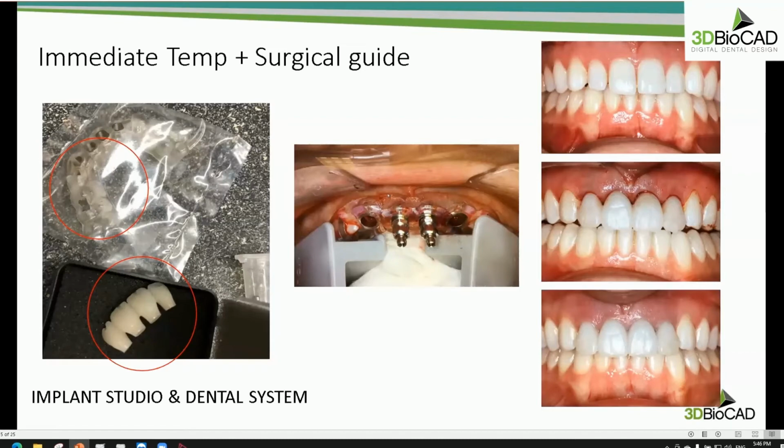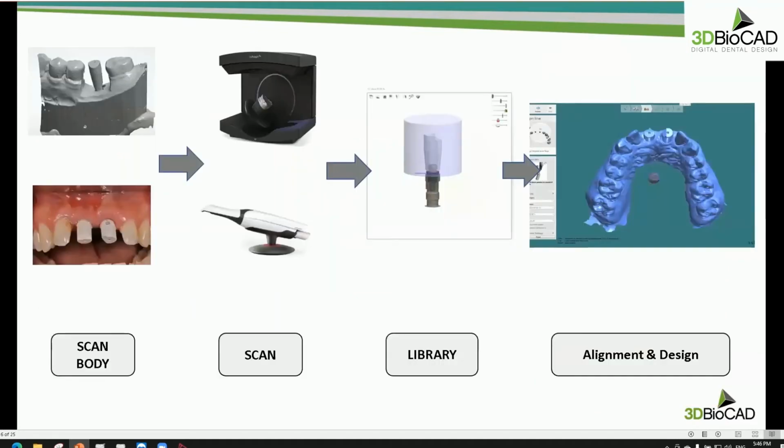Okay. One thing, normally for this way, for the left side, actually I couldn't cement it for my doctor because never know the implant angle or depth or the engaging could be a little different with the implant planning. So please keep in your mind. Okay. Let's go to the next view.